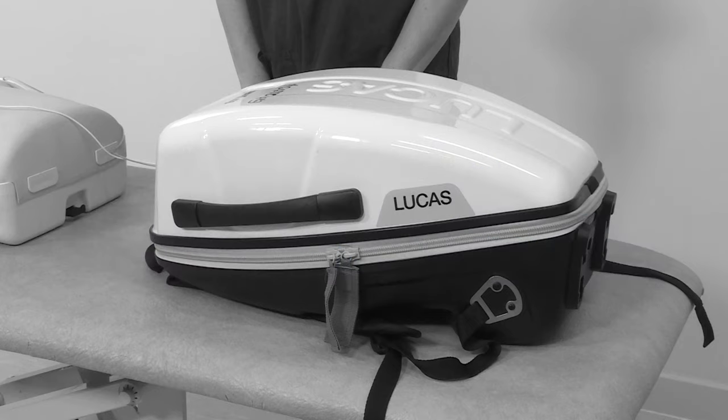This is an instructional video on how to use the Lucas Machine. The Lucas Machine is a device useful for the delivery of external chest compressions to a patient in cardiac arrest, especially during extended CPR when fatigue may prohibit the delivery of effective compressions to the patient.